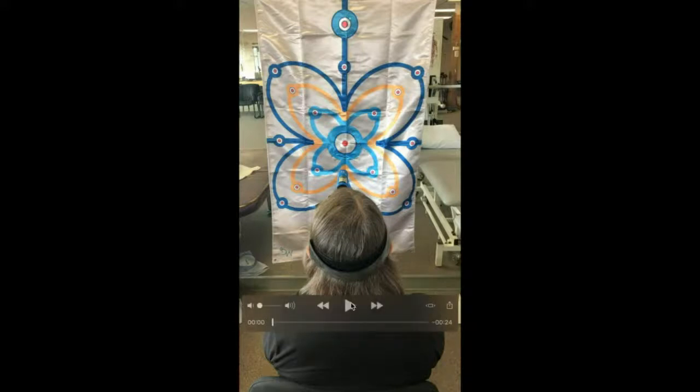So as she does this, you'll notice there's a dominance of left dominant laser movement, suggesting that she has good function of the left-sided system. And when she goes to the right, she starts to shorten that up. So typically this crease in the flag here is where she ends up. And oftentimes the laser goes all the way off the flag to the left. So she's left side dominant, and she also has titubation. So she can't control this smoothly going back and forth.